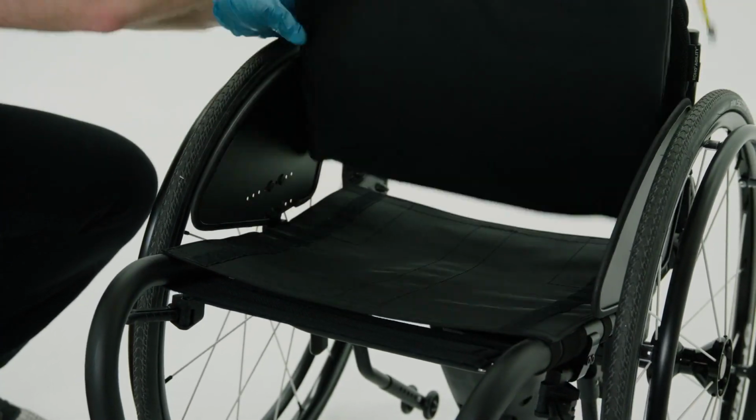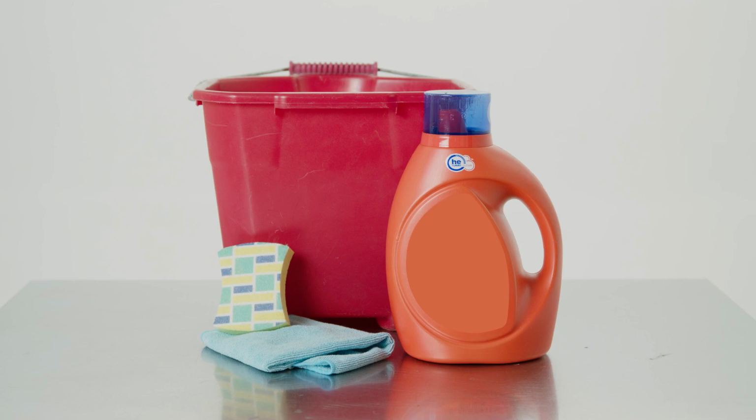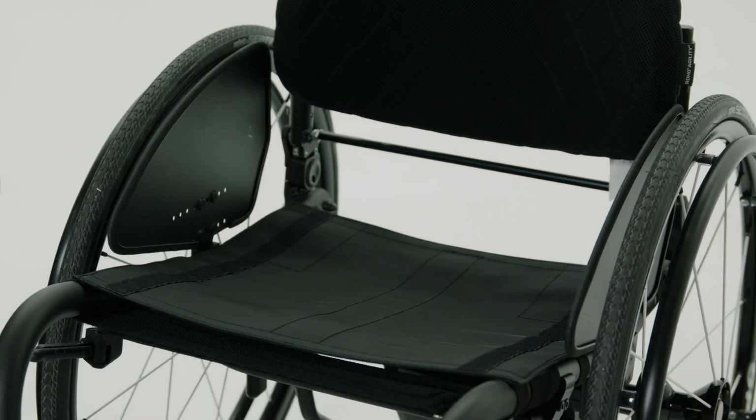You should also hand wash the seat sling and back upholstery using water with mild detergent. Always allow the upholstery to air dry completely before using the chair again. You may also use a soft clean cloth with soap and water to clean all other components. Immediately dry all the components and any other parts of the chair that became wet.